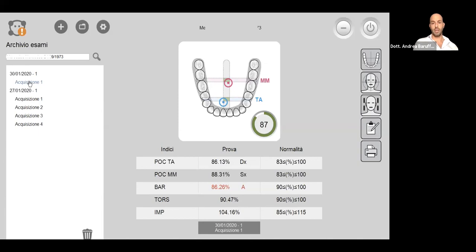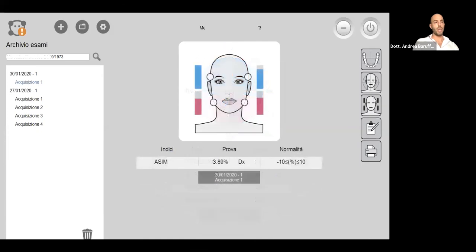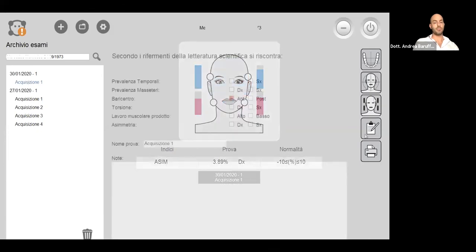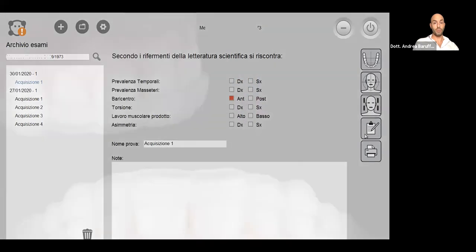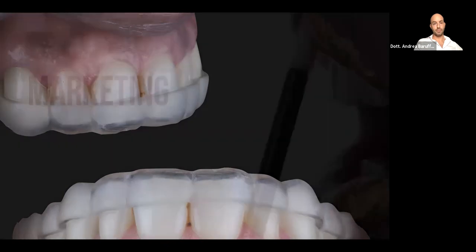The torsion disappeared. So in this condition, we are going to make an individual occlusal splint. The osteopath kept working on this patient about the proprioception, and this splint aims to decompress the TMJ.